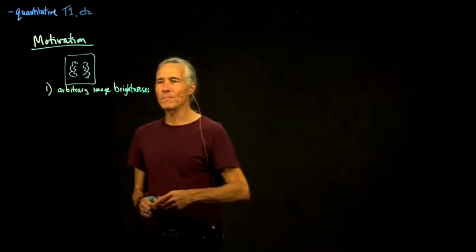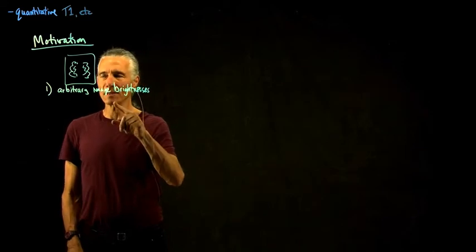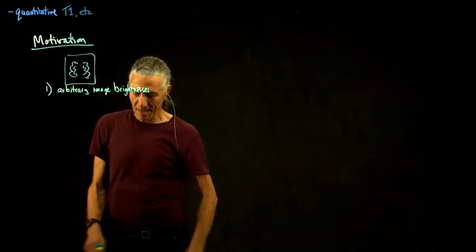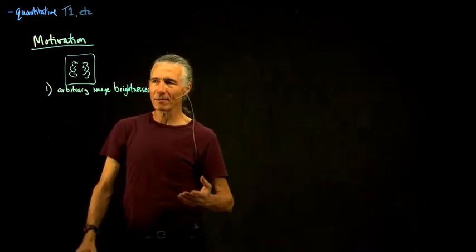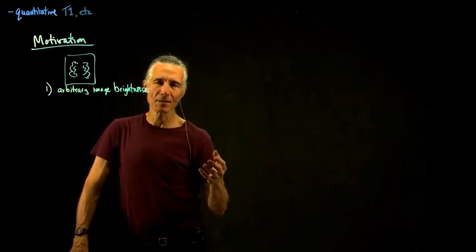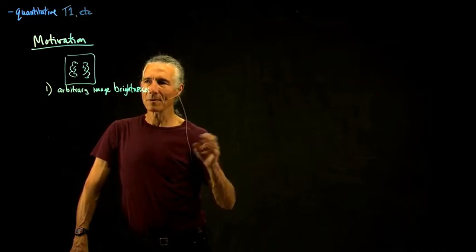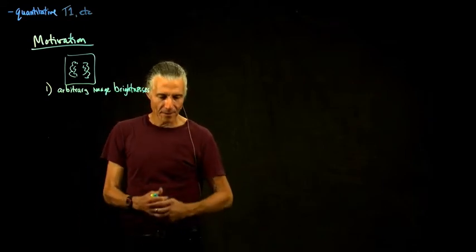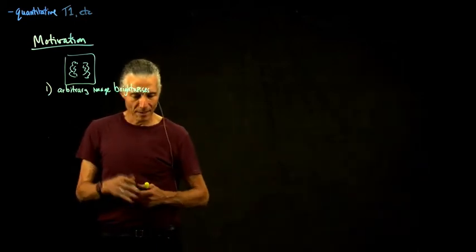So if you had some way of actually estimating what the T2 was or the T1 number was, then that would be better, because then you could say, well, we've seen a difference in the brain, or we can see that your brain is a little bit smaller or larger in this number than it should be. So that's the first motivation, to get some kind of quantitative number.